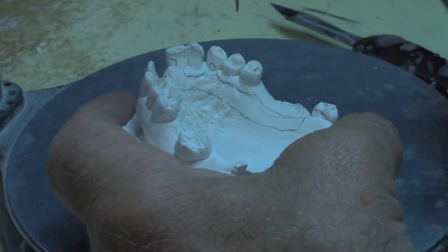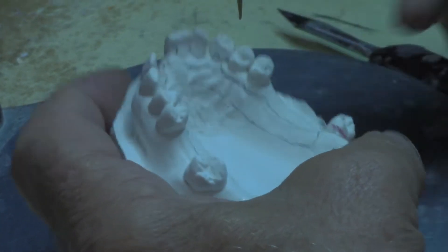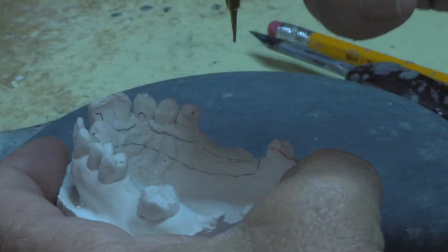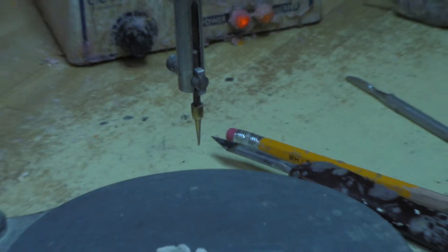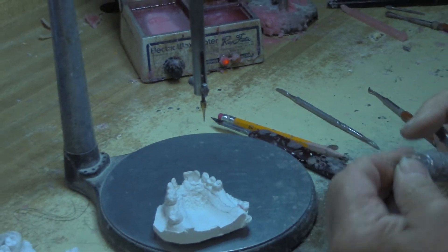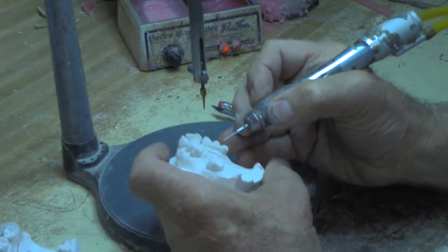When I put my post-dam in, I use a small round burr and basically make my post-dam with that round burr, just a tiny little bit.